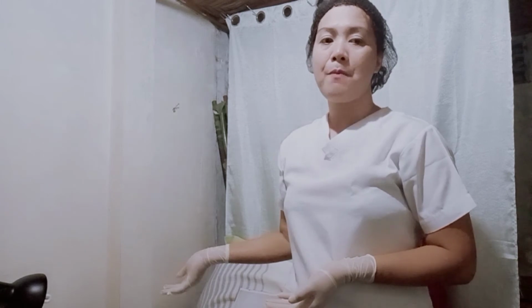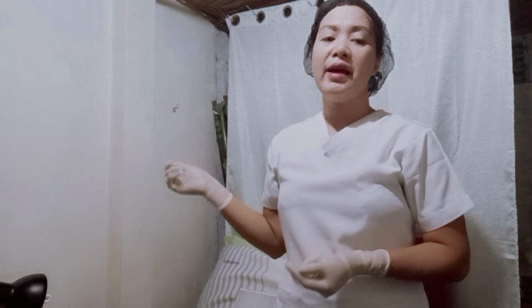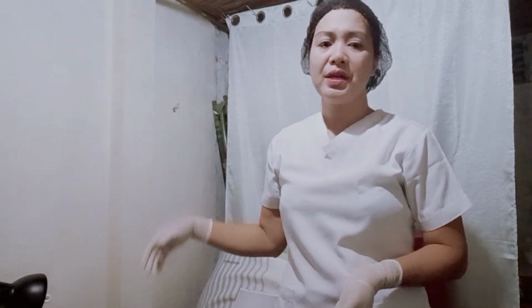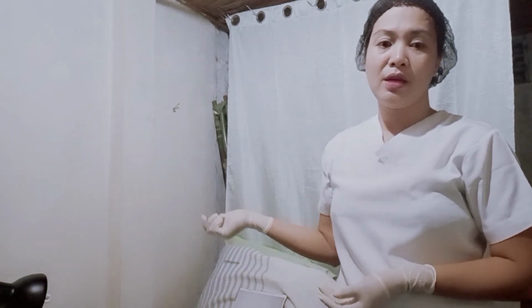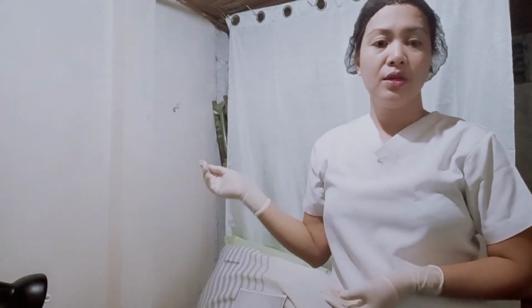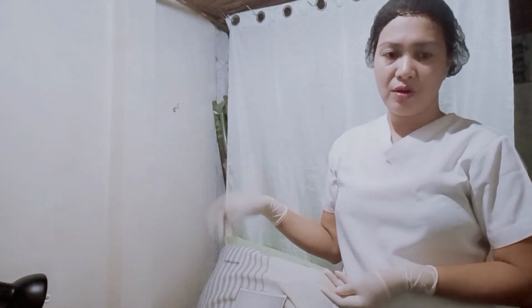If the indwelling catheter is separate from the bag and tubing, remove the protective cap from the end of the tubing and attach the drainage tubing to the end of the catheter. Then secure the catheter loosely with tape to the inner aspect of the thigh, with the drainage bag hanging preferably away from the door. Make certain that the tubing is not caught on railing locks or obstructed.